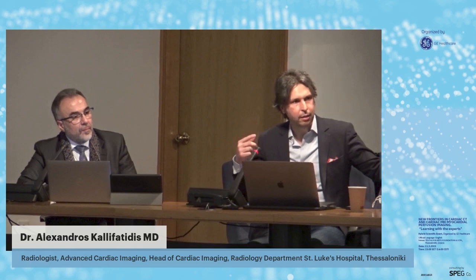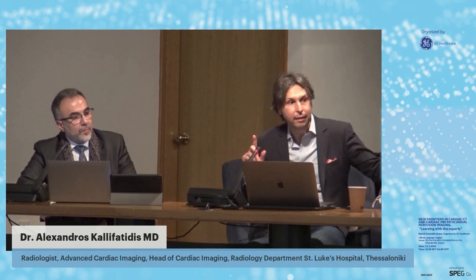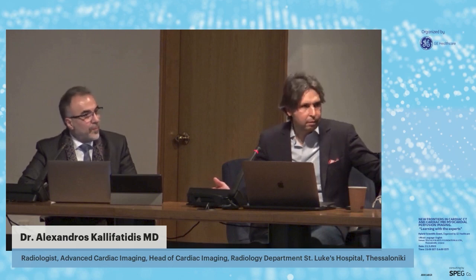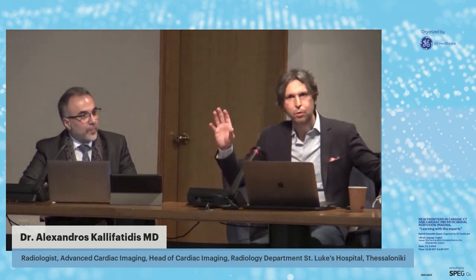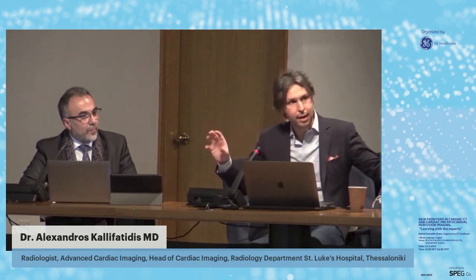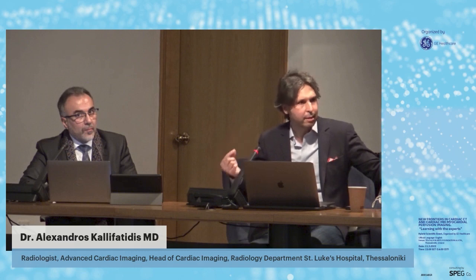Folding artifact or not? Yeah, during perfusion. Yes, during perfusion. The dark rim artifact. It can happen. As I mentioned before, there are some characteristic features of the true perfusion defect and the dark rim artifact. Usually, it is very thin, one pixel size, the dark rim artifact.